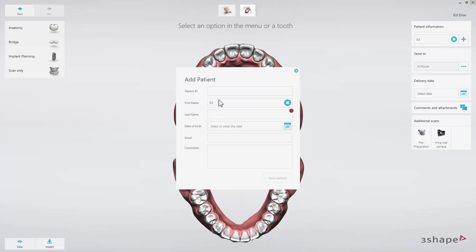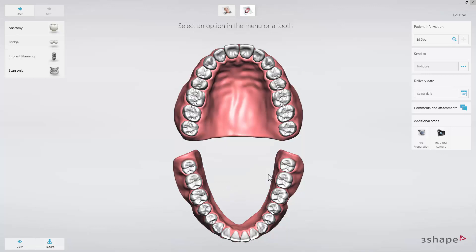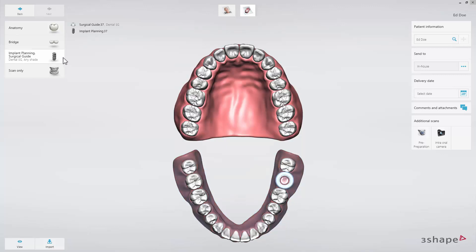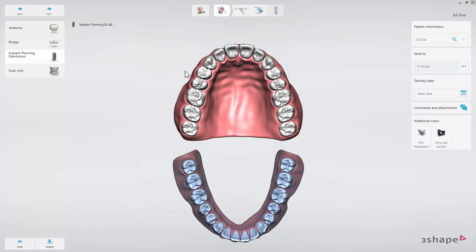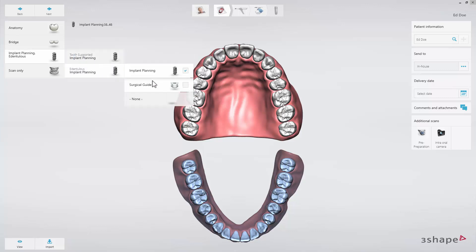We can now proceed to set up the case for edentulous implant planning. Choose a single tooth and click on the implant planning tab. In the drop-down menu, choose edentulous and implant planning. Also select surgical guide if you want to design a guide for this case.